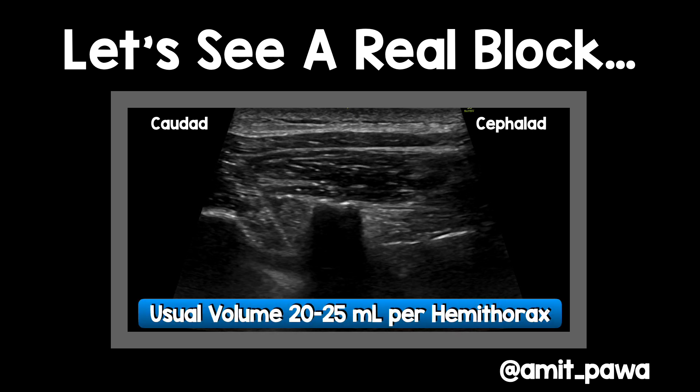You can see the needle tip is just about to reach the superior costo-transverse ligament but the pleura has already dropped. This is one of the things that can happen — the superior costo-transverse ligament isn't completely impervious, so if you're right at or just behind the ligament, some of that local anaesthetic can cross into the paravertebral space, giving you a lovely depression of the pleura. The next phase is to advance the needle a little further into the space; I generally use a volume of 20 to 25 mils per hemi-thorax.